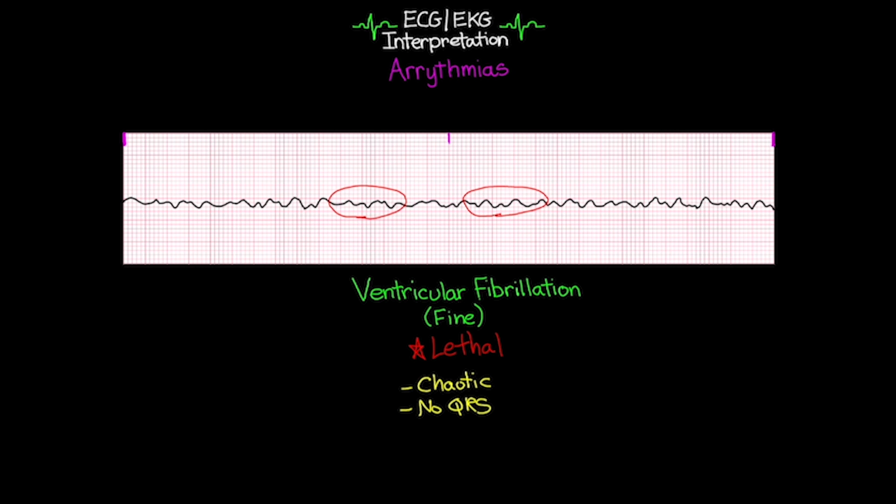And finally, we rounded it out covering ventricular fibrillation, or VFib, again in a couple different variants that you're going to see. The vast majority of these ventricular rhythms are absolutely vital that you are able to recognize and interpret, because for the most part, they either require some sort of immediate intervention or will lead to some sort of emergent intervention for your patient, such as initiating ACLS or something to that effect. So very important that you know these ones.